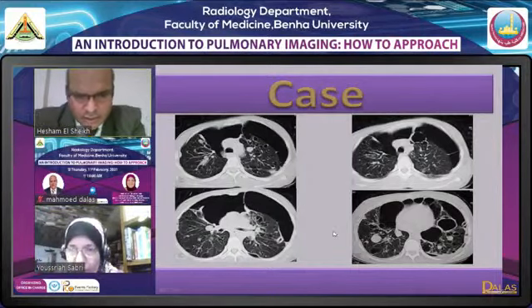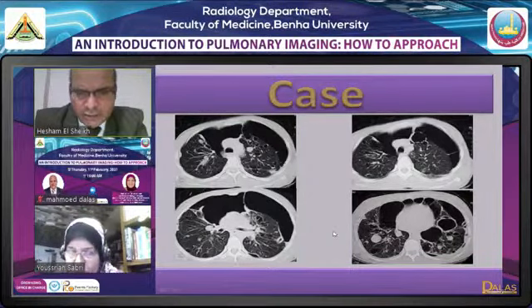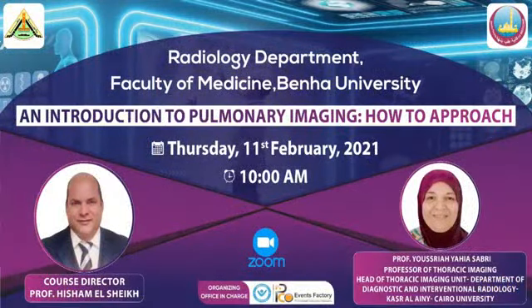Another, I think this is an easy question. How can identify a central mass in totally collapsed lung? طيب بالسي تي ولا بلين اكس راي؟ بالبلين اكس راي مش هشوف. يعني الا بقى لو واحد مكشوف عنه الحجاب وبينه وبين ربنا عمار وحاسس بقلبه ان في ليجن جوه. بالسي تي بمنتهى البساطه الماس ده هيبقى ديماركيتد من اللي حواليه، يعني هو هيبان لوحده كده، هيبقى ديماركيتد من اللي حواليه ان في جوه الوسعايه دي في انذر ليجن.